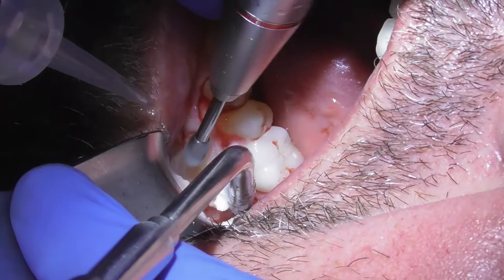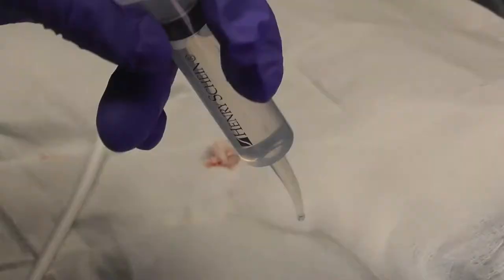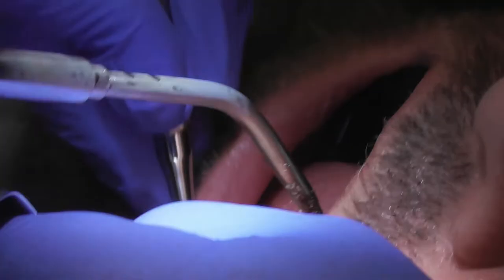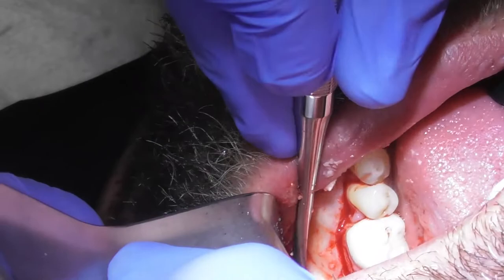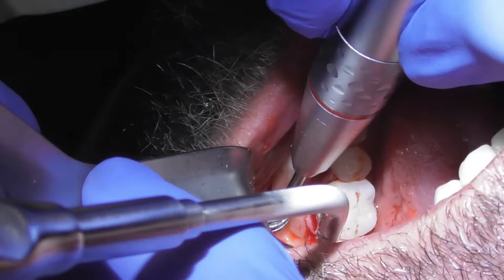Let's go ahead and give you a chance to reload some of the bone — if you were doing dental implants this stuff would be beautiful. It's always people that don't need bone grafting that have awesome bone. We've got most of this gone — debulking it to start off with — and then I'll go ahead and feather things out and make sure things are smooth.